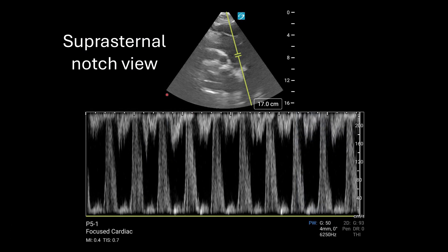Here's one more advanced way to determine severe aortic regurgitation. You'll obtain the suprasternal notch view — here is the aortic arch and the descending aorta. You'll place the pulse wave sample gate in the descending aorta. Everything above the baseline is blood flow going towards the probe. You'll see holodiastolic flow reversal in the descending thoracic aorta, indicating that blood flow is moving the wrong direction in diastole — and this means you have acute severe AR.